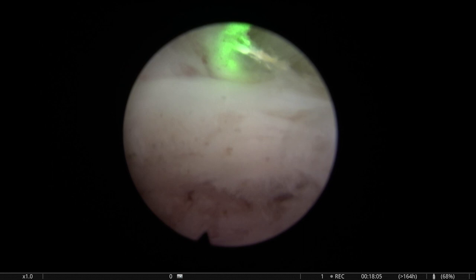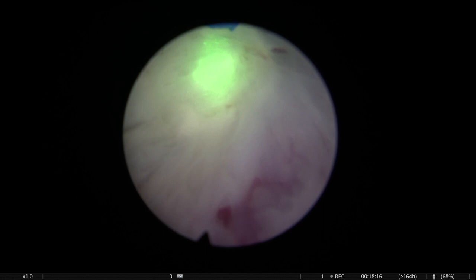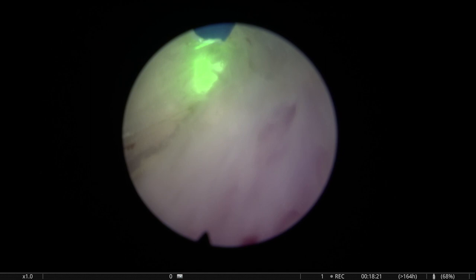Here again, we see that the block approach provides us with a very good visibility. We are irrigating just this small space between the capsule and the adenoma. And even when there is bleeding, the blood is going to be washed out and the visibility will remain clear.